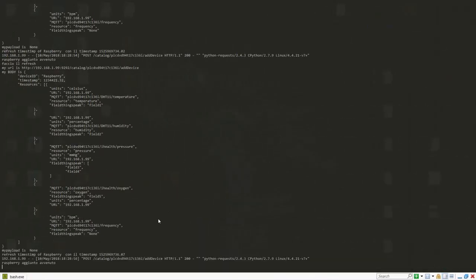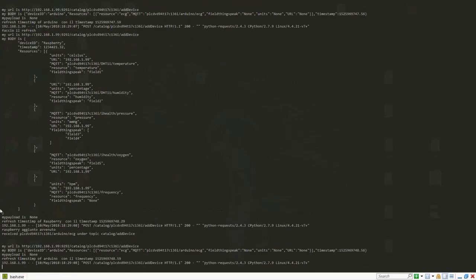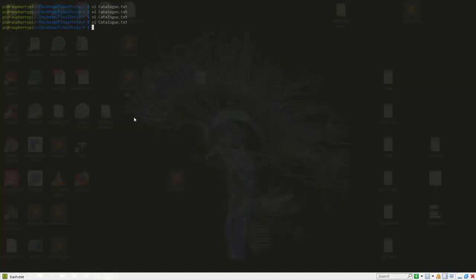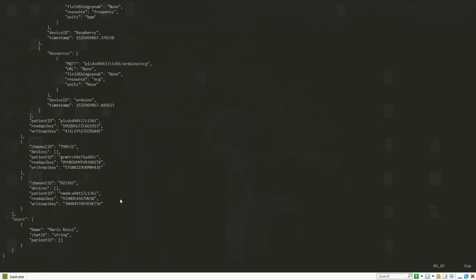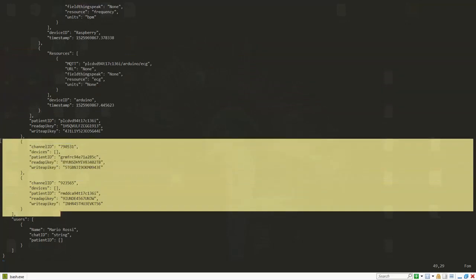Now we will connect also Arduino, and we will see that on the trading it will receive also a message from Arduino. Here it is really fast, but as we can see also Arduino timestamp is updated. Now if we go again to the catalog, we can see that the first patient has also now Arduino. This device before was not present, but the second and the third patient have the list of devices still empty.